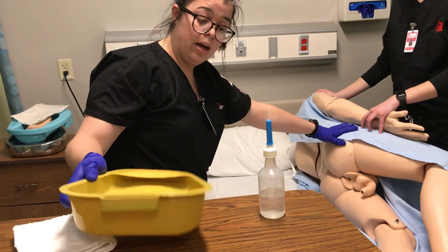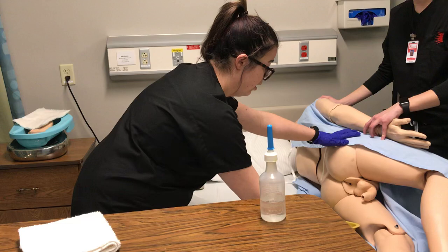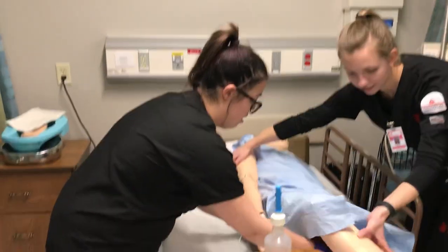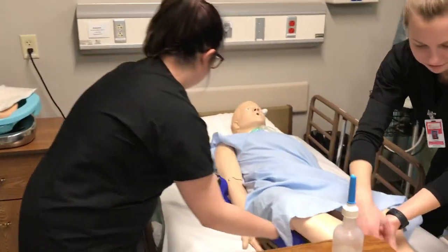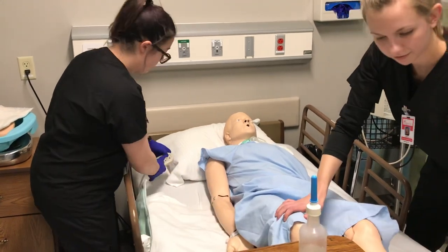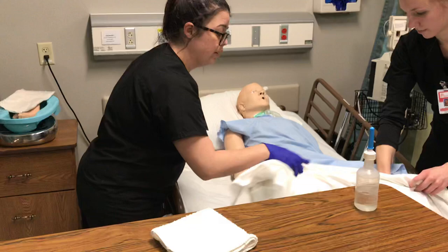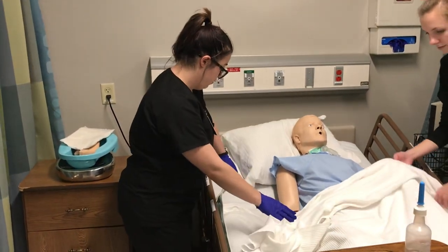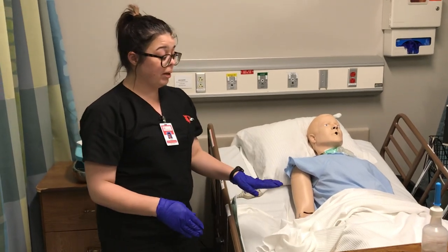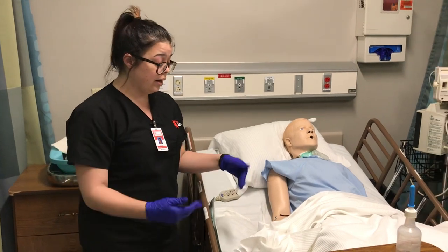Then I would place a lubricated bedpan under the patient and roll him back down. I'm going to put the bed in a semi-Fowler's position and cover them up so that they're feeling okay. I would make sure the bedpan is there no longer than 15 minutes to prevent any breakdown.